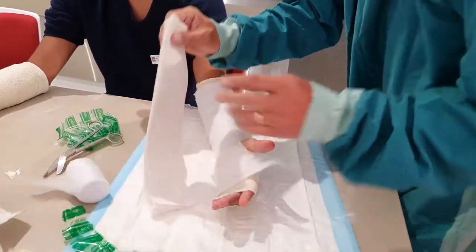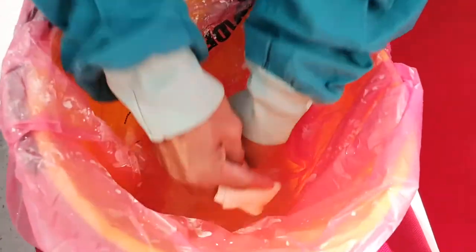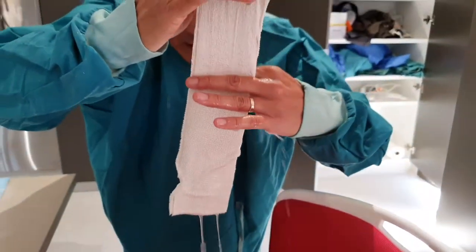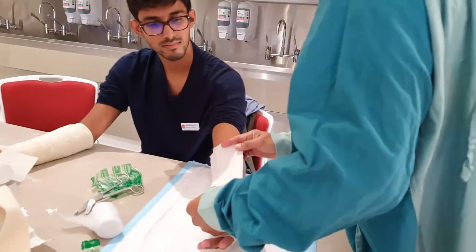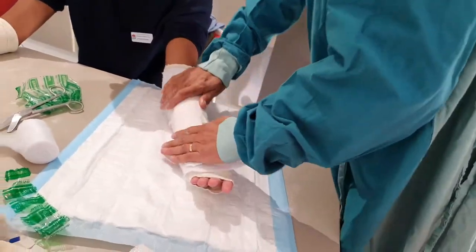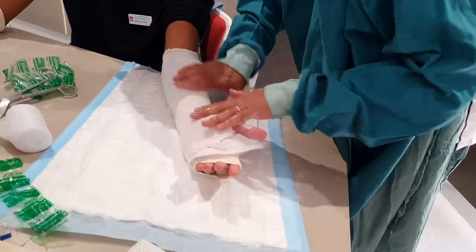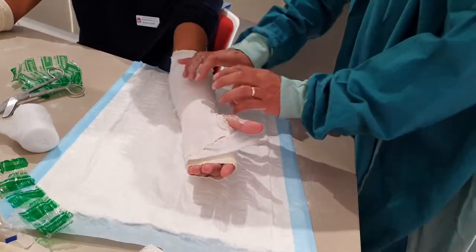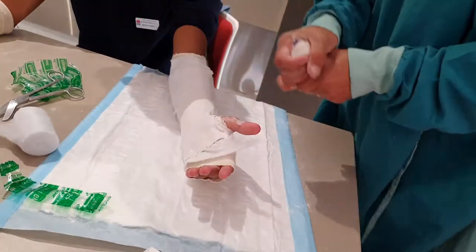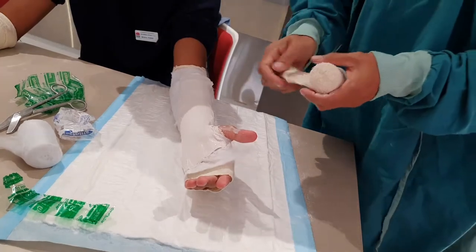I don't want him doing this, so I'll probably add a little bit more plaster there. Warm water — I like to hold my plaster like this, submerge it in the water, take off the excess, and then just put the plaster down. I don't mind it being a little wet because it molds in with the rest of the material.